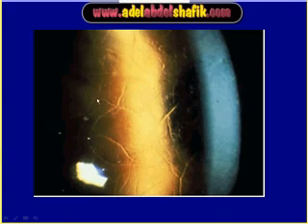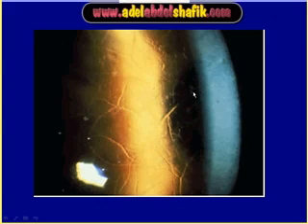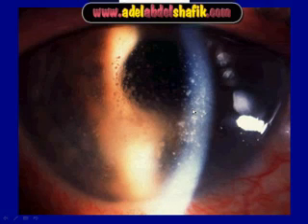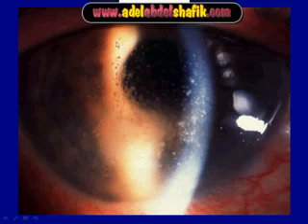The same principle applies here: these lines against light coming from the iris represent direct retro illumination, and these dots and short parts of lines against blackness represent indirect retro illumination. Again you can see some lesions against the iris and some lesions against the pupil.